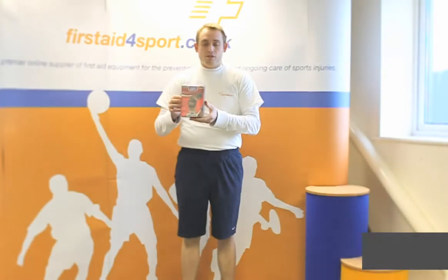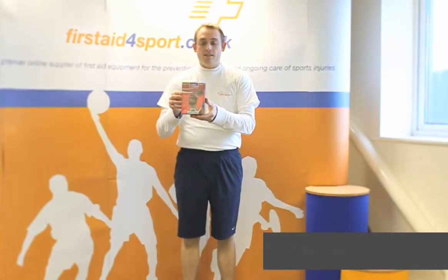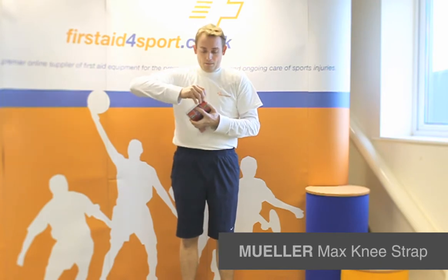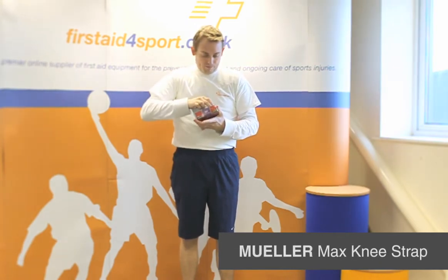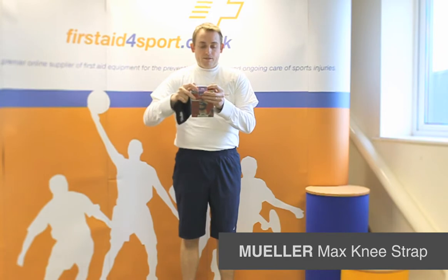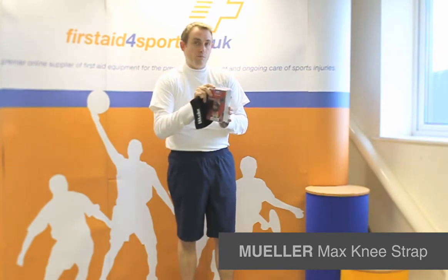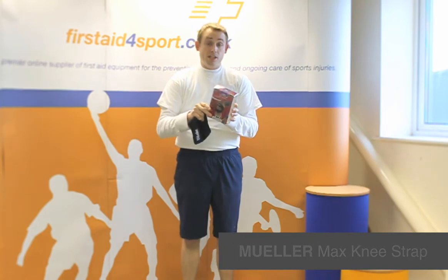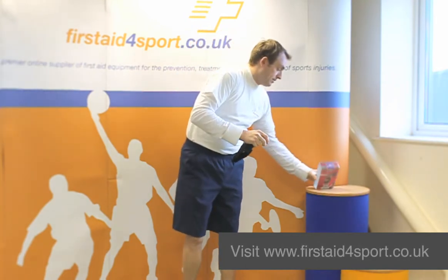I'm Michael Davison, Managing Director of First Aid for Sport, and this is the Muller Max Knee Strap. The Muller Max Knee Strap is designed and recommended for people with arthritis, Osgood-Slatter Disease, and Patellar Tendinitis.